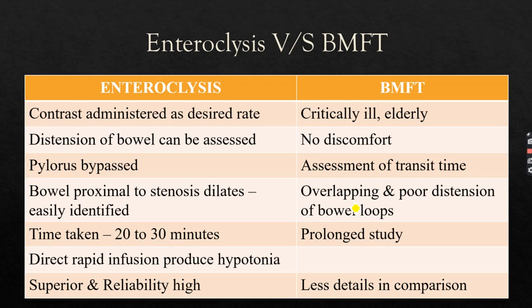Whenever we are comparing these two, the superior one is enteroclysis whenever small bowel diseases are concerned. Whereas BMFT is usually indicated in critically ill patients, elderly patients, and patients who cannot be intubated with this BD tube. So barium meal follow through is one of the options available. Even if enteroclysis is not possible in those patients, the BMFT is another option. There is no discomfort as is seen in enteroclysis during intubation. There is less radiation exposure in BMFT as compared to enteroclysis.